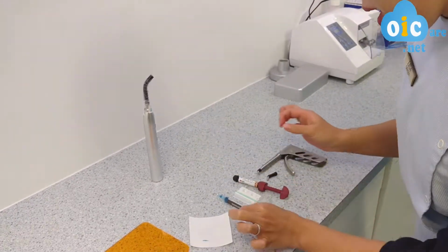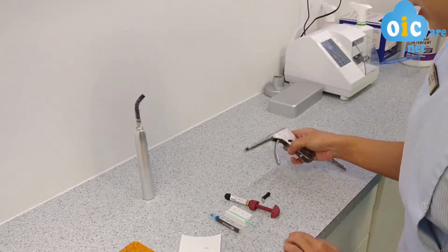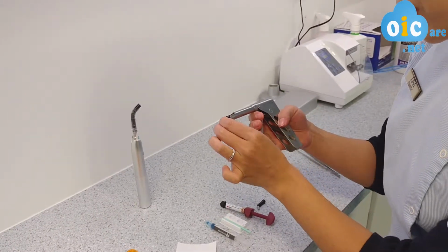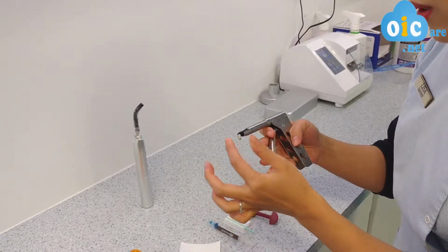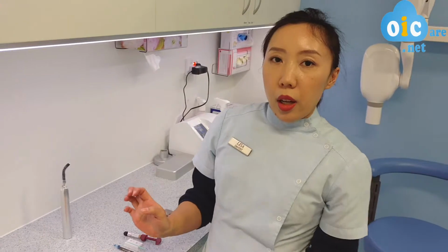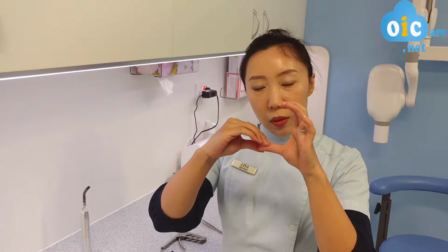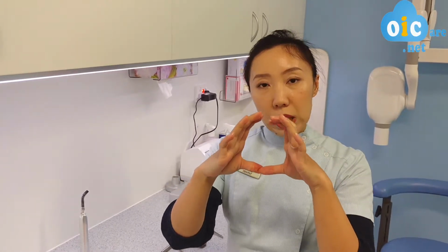They also come in capsules like these. We put these capsules in composite guns. This is what we call the gun. We take this little cap off and we squeeze it and it comes out. I don't want to waste any material, so this is just to demonstrate what these all look like. With the composite resin material, we layer it down layer by layer. If your hole was this big, we put in sections of it like this size and then that size, and layer them until they fill your entire hole.